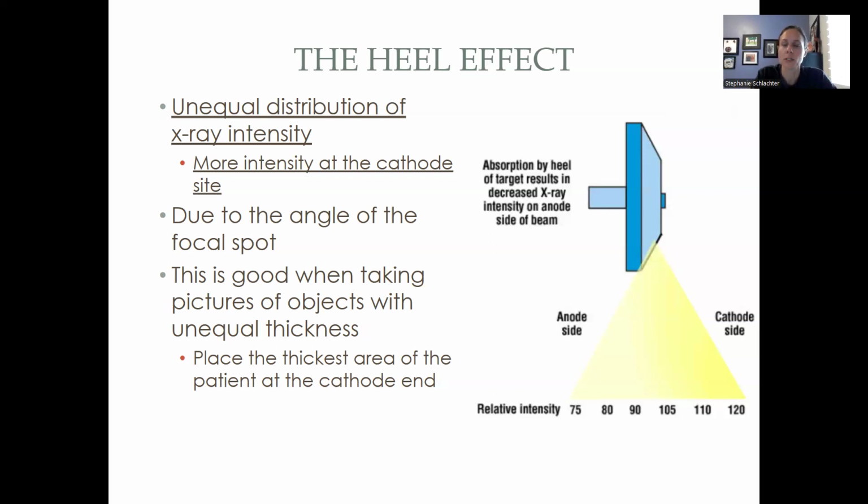But what happens here, so you can see in this picture, and we talked about it last week, that blue thing in the picture, that is our rotating anode, right? We have that disc and, think of it as a plate when you look at it from the other angle, right? We're looking at it from the side on this picture. In the front, it's a plate and it's always hitting kind of at that same spot as the plate spins. From the side, you can see we have that angle, okay?